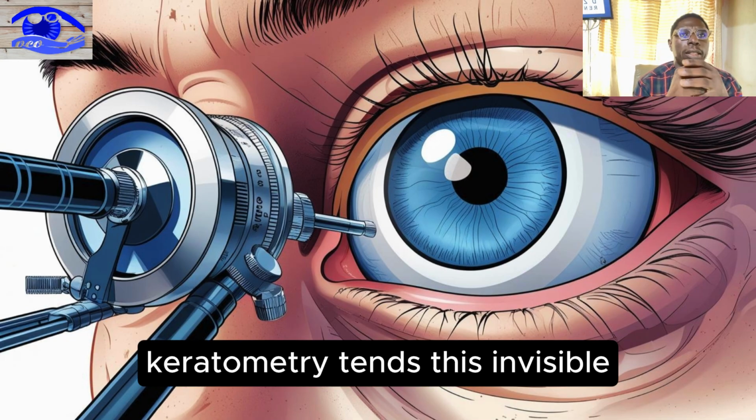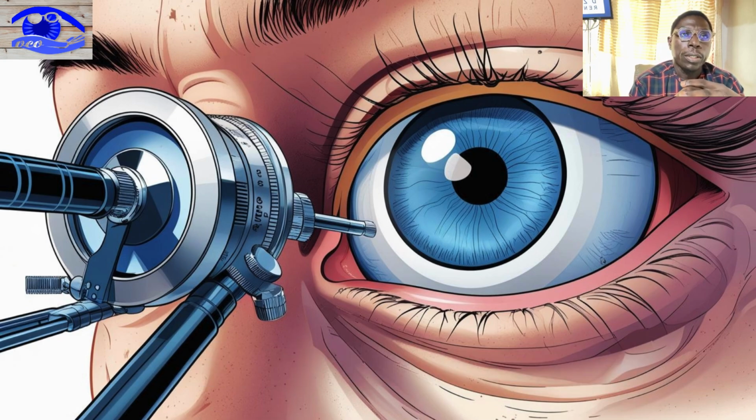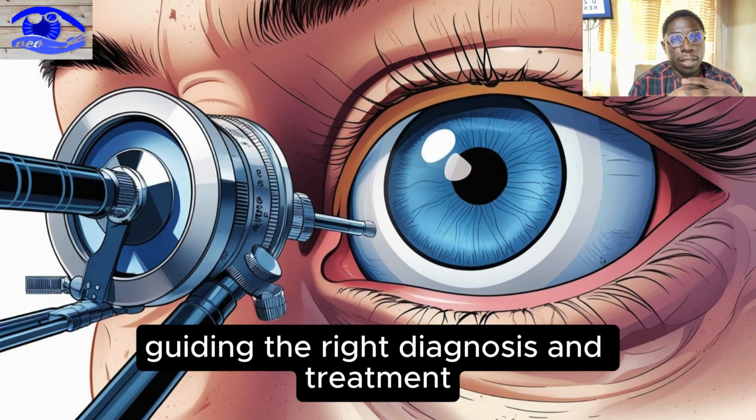Keratometry turns this invisible problem into measurable numbers, guiding the right diagnosis and treatment.